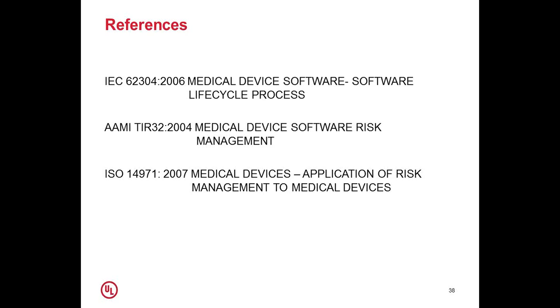It gives you guidance on how to prepare a software risk management and what to consider. ISO 14971 is a guidance standard which discusses risk management for medical devices. This is a general standard for all kinds of medical devices, and it is necessary for any medical device manufacturer to use this particular standard.